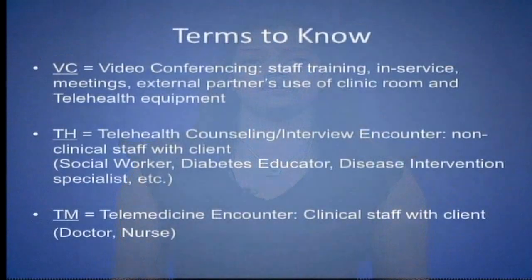Before we begin, there are some terms to know. VC, which means video conferencing, is when the CART is used for video conferencing for occasions such as staff training, in-service meetings, and external partners' use of the clinic room or telehealth equipment for non-clinical reasons. TH means telehealth, counseling, and interview encounter.